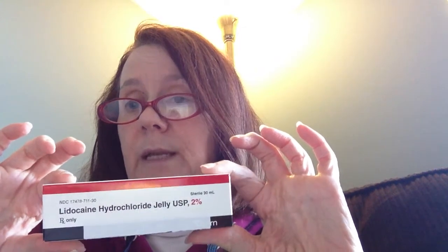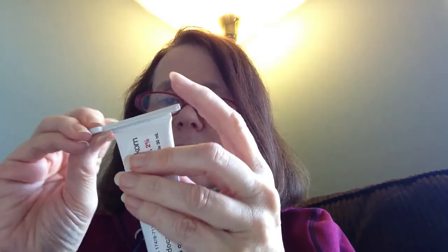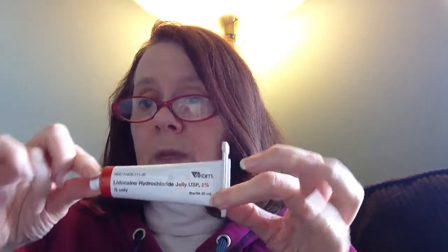But when I'm getting ready to do a catheterization, you take out the tube, obviously. Here you go. Your wonderful handy-dandy tube of lidocaine gel. I love it. The nice thing about it is that they also come with these lovely handy-dandy little things that you can put on the end as you go through the gel. Like with the toothpaste thing, you can roll it up so that you get every little ounce out of the tube that you possibly can. And since you're paying for them, like me, you want to squeeze out every last ounce of it.